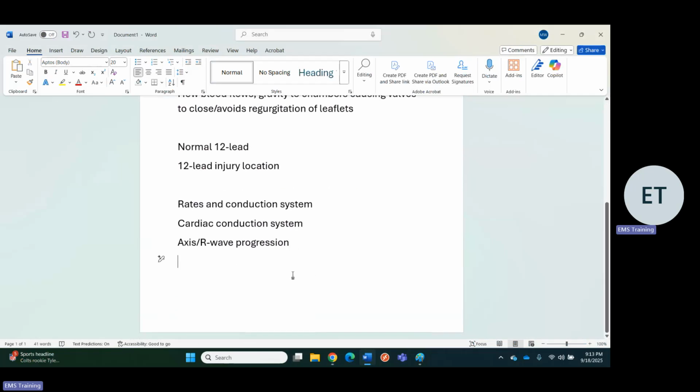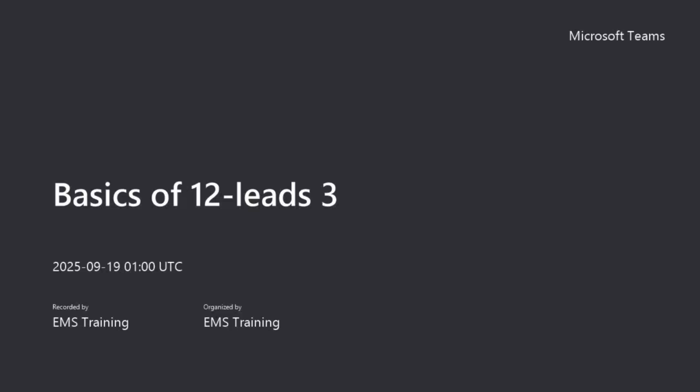And then also just know that anytime there's something that interferes with electrical capture from the ECG leads on the chest, anything that dampens that electrical signal, it moves well through just a little bit of tissue and just a little bit of air. Okay, hyperinflated lungs, subcutaneous fat or obesity, positioning, depending on the patient's condition. Like if they can't lie flat, or if they can't sit up, how are you doing a 12 lead on a prone patient, maybe like that picture that they just showed.